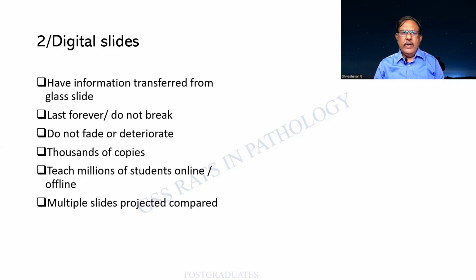Now, what are the advantages of the digital slides? As I had mentioned earlier, they have the information transferred from the glass slide. They last forever, do not break, do not fade or deteriorate. Thousands of copies can be made. So, you know the importance of it. And it can teach millions of students online and offline. And also, multiple slides can be projected and compared.